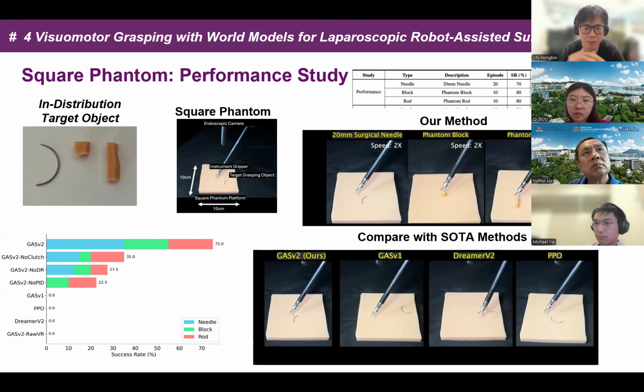I think the hardest part is trying to grasp an object in a random position. And when you finish the grasping, you can switch to a predefined trajectory, and you can use some script policy, like you program some policy and hand over to the other arm of the surgeons, right? We can just switch from the RL policy to the traditional control policy or the script policy.